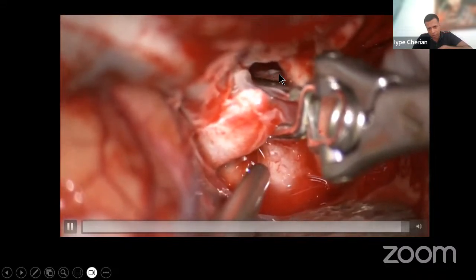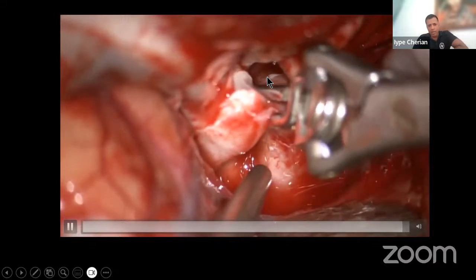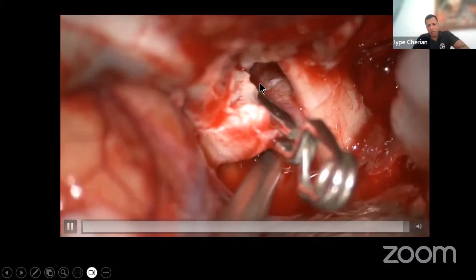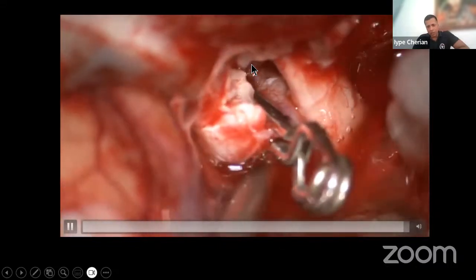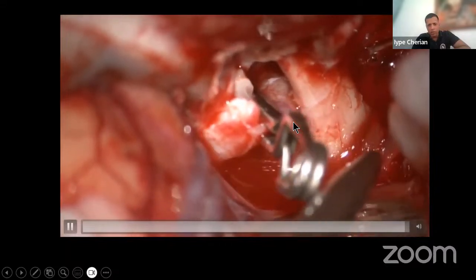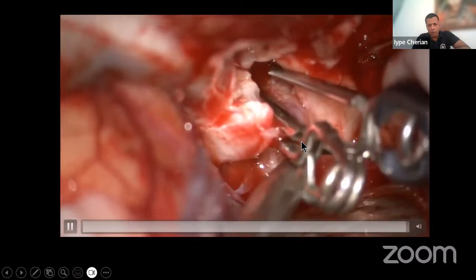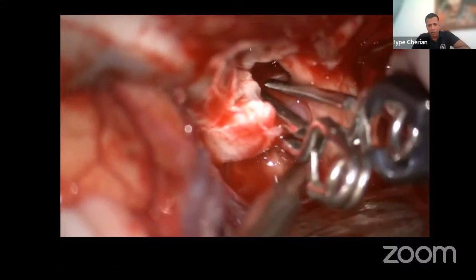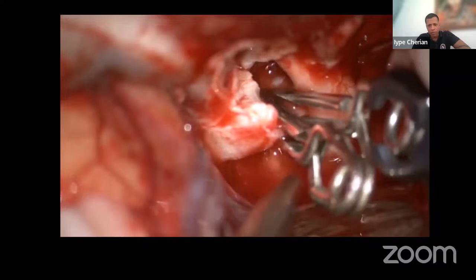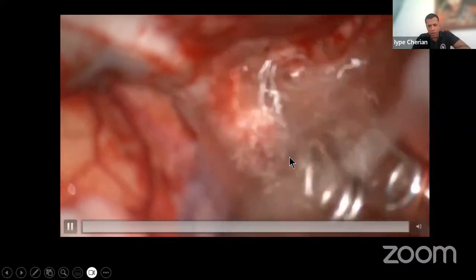That's a vertical cavernous carotid. That's the cavernous sinus. Okay, the sixth nerve is posterior there. Okay, there's a small dog ear here. We can handle that with another small clip or big clip, and just clip just enough. Yeah, so that's the vertical carotid, and done.